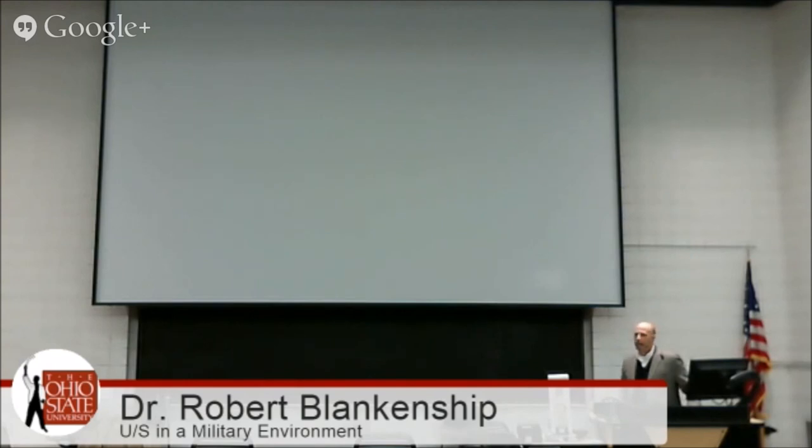It's really nice out here in the mud huts to take a look at these kids and say, hey, I think we have a problem, or I think we don't. But we definitely found that MSK is a much bigger issue. Somebody comes in and they sprain their ankle, it doesn't look too bad, but if you look at their ankle and they have a big effusion, the nice way to treat patients is to do an intra-articular block. You give that patient really long pain control, and it allows you, in some cases, to reduce ankle fracture dislocations with absolutely no chemical sedation whatsoever, and the patient has a pain-free experience.